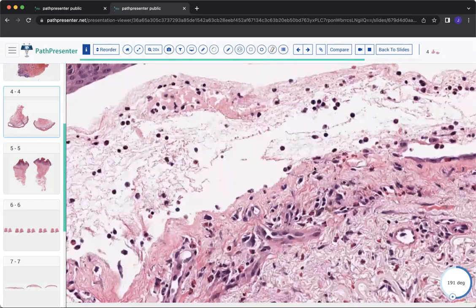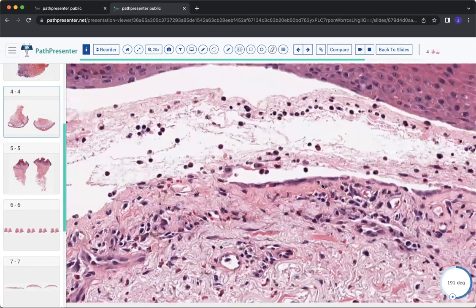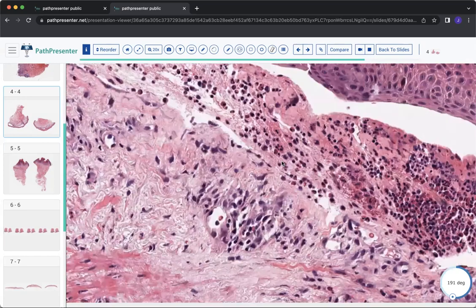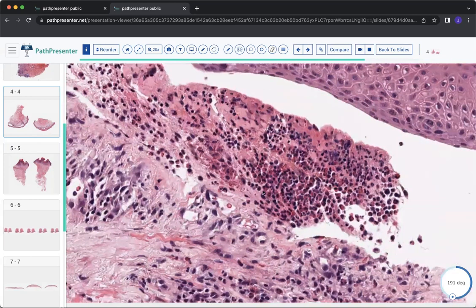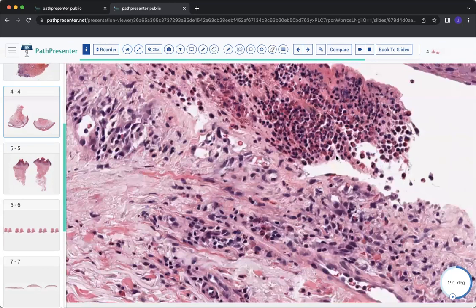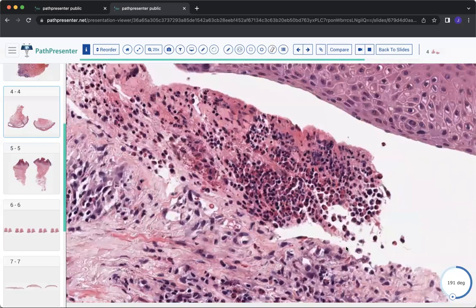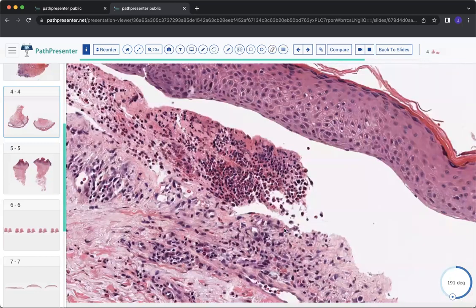It looks like this was scanned at 20x, so it's a little bit harder to get into the blister infiltrate here, but I hope you can appreciate these bright red to pink granules in many of these cells. So this has a healthy amount of eosinophils. Subepidermal blister with abundant eosinophils, you can think about bullous pemphigoid. This is classic for bullous pemphigoid.